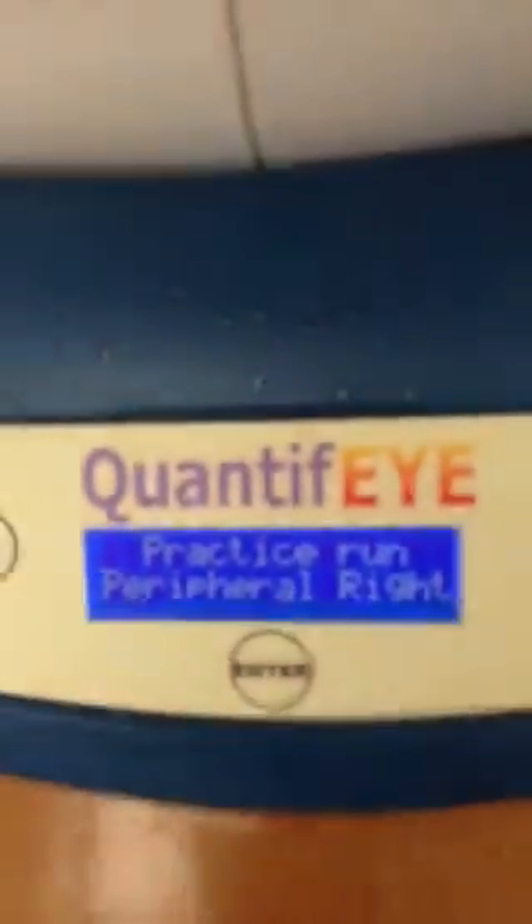This instrument is monocular, but you're using it to test each eye. Right now this would be the right eye testing in demonstration mode, and in an actual clinical setting you would test the left eye as well. Here you're to look at the red dot and press the button when you see the blue dot flickering, which tests your peripheral xanthophyll pigment.